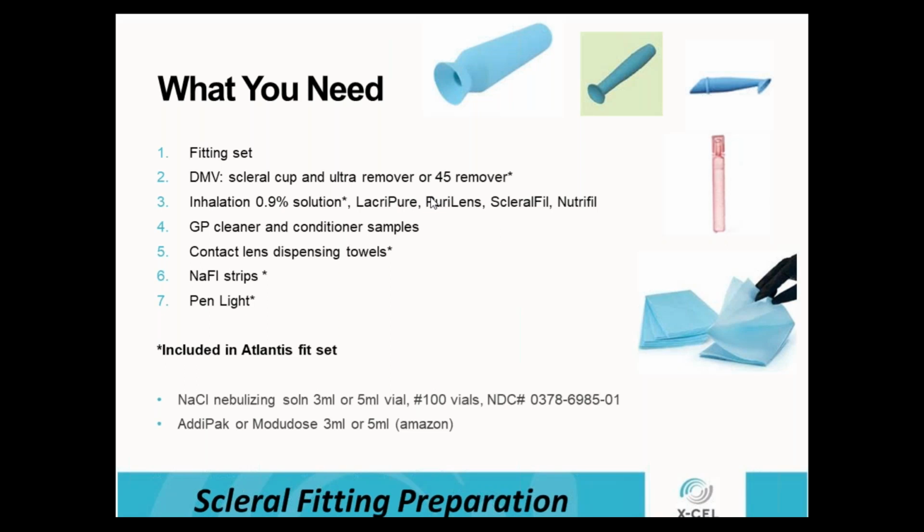If you don't have preservative-free saline in your office during the trial fitting process, you can just use any saline, even if it has preservatives, due to the fact that you're not really going to have that lens on for 5 or 6 hours. In that fitting process, it's going to be 30 to 45 minutes, and we're not too worried about those preservatives having some negative effects to that cornea. So if you're really desperate, you can use other salines that have preservatives or tears to actually do that trial fitting. I always have GP cleaner and conditioning solution.